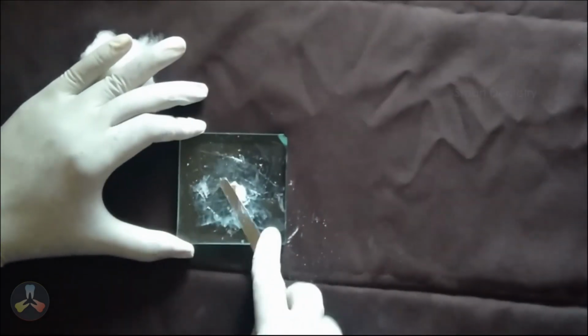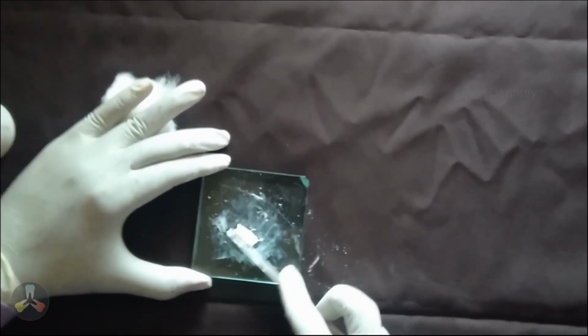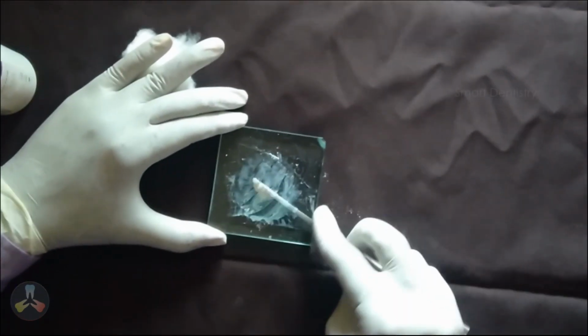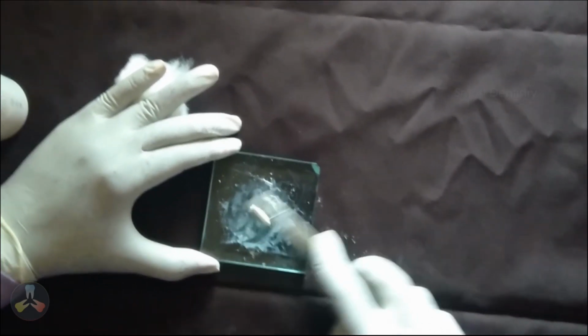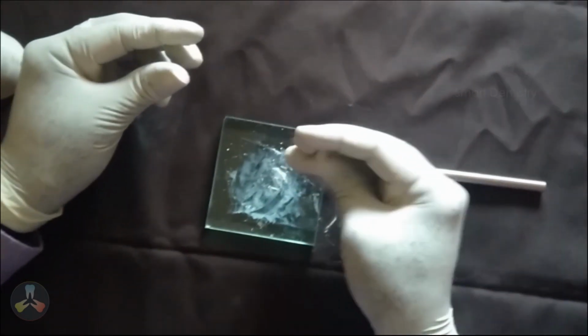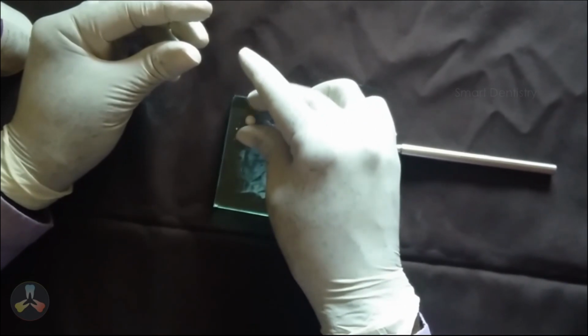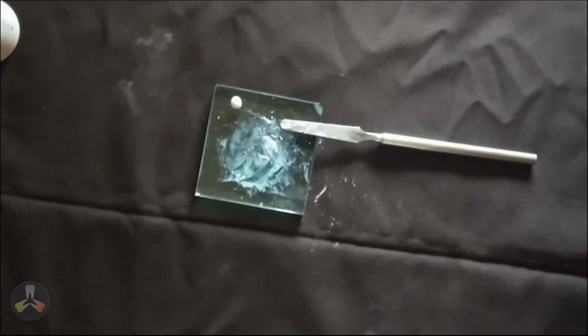Take 1 or 2 small wisps of sterile cotton fibers. We can incorporate those cotton fibers within the mix and get a putty consistency, a thick mix of zinc oxide eugenol. It is always a good habit to take the zinc oxide eugenol after a good mix, kneading it in our hand. So I can ensure that this temporary mix is going to be one of the best temporary cements.